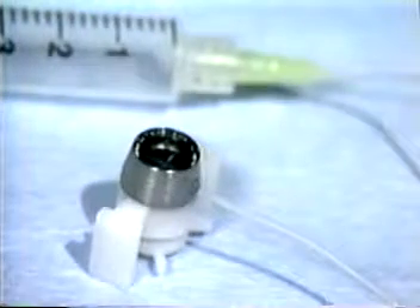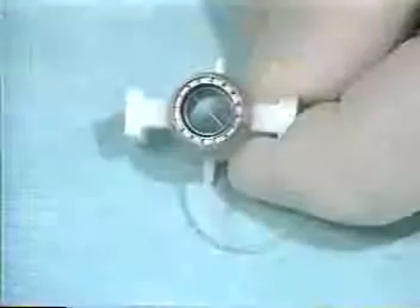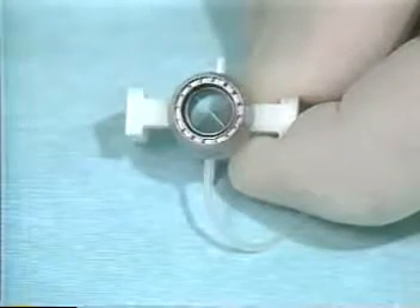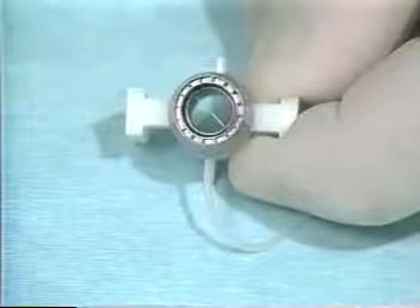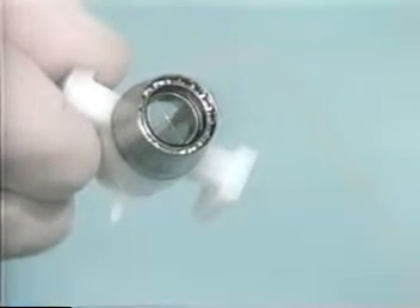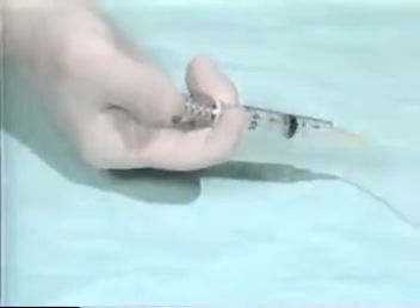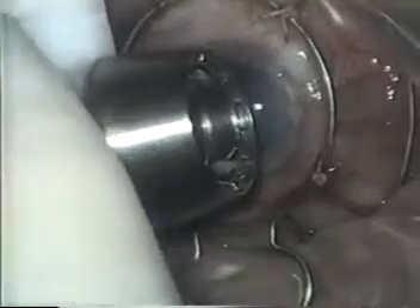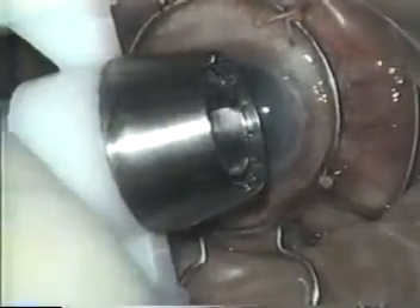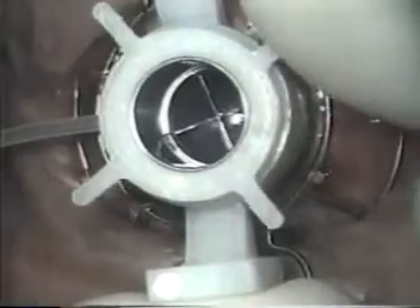The second part of the Barron system is the radial vacuum trephine, used to cut and mark the recipient cornea. It consists of a body and a blade assembly. The hollow walls of the body encase a vacuum chamber ending in 16 radial markers which will mark the cornea for suture placement. There are two plastic struts for holding and stabilizing the body. The vacuum chamber is connected by a small silicone tube to a syringe with a spring-loaded plunger. The blade assembly is made up of a movable circular blade, crosshairs for centering, and spokes which are turned clockwise to lower the blade and make an incision or counterclockwise to retract it.